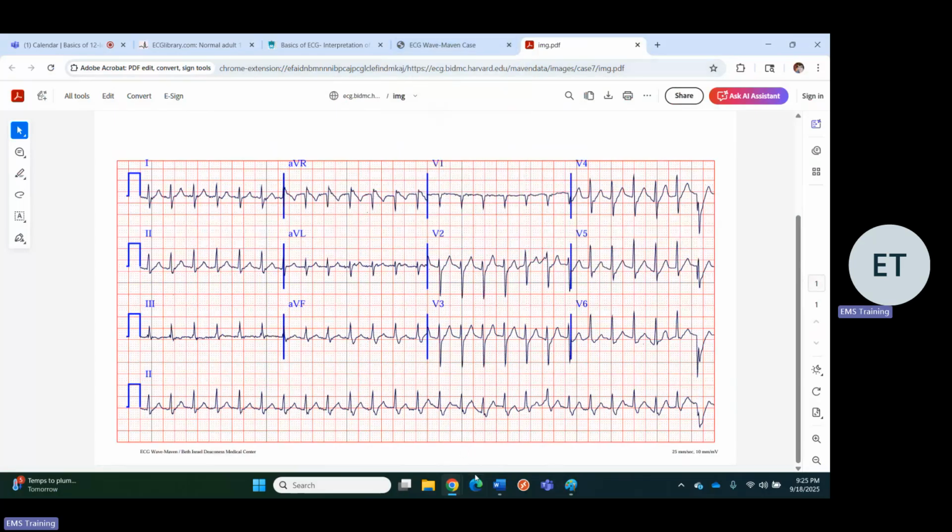This one's interesting. There's a slight wandering baseline when we get here, but honestly, it looks like there's a variable R wave peak, and it's associated with a change in size of this S wave, large and small, large. And it looks like it's large for the rest of it. Then there's some artifacts, so I can't tell. It's kind of bizarre.